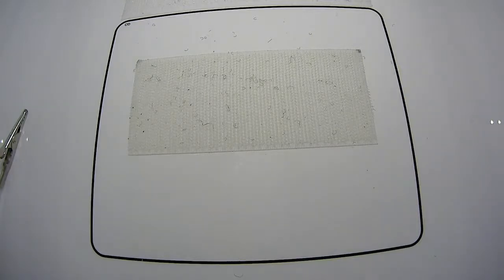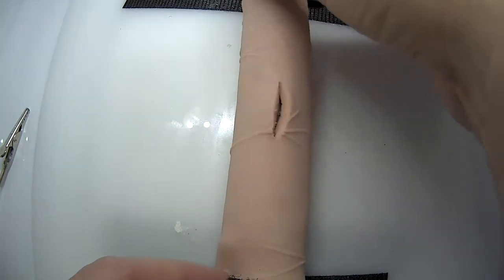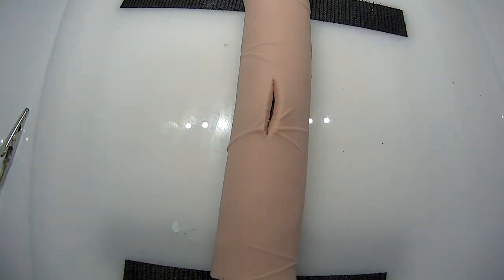In this demonstration, we'll show you how to perform a two-layer bowel closure that is useful for an enterotomy or anastomosis. First thing you'll need is the plastic insert with Velcro. You're going to place a piece of bowel on the attached tube. You're going to have a 2-centimeter enterotomy cut in the bowel.